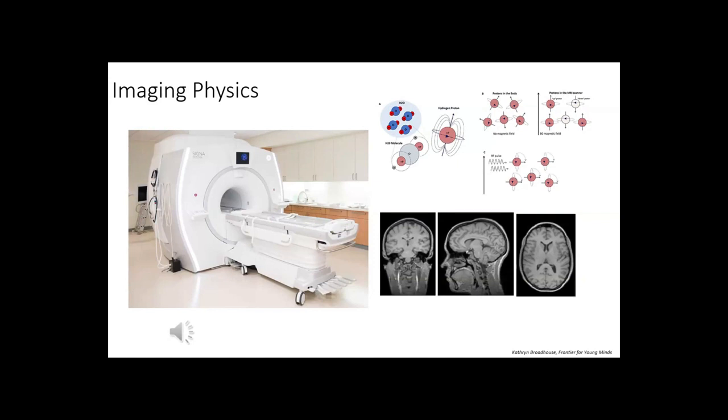Maybe half of them are doing this, half doing that, and then after we run this through the coil, we flip them. All the water molecules go that way, because we have the coil giving an external stimulus. Then we stop, and those molecules gradually go back to their previous status, half going up and half going down. This is the time we call relaxation time.